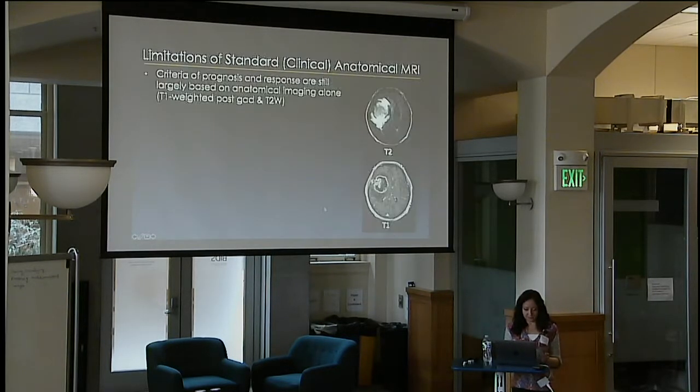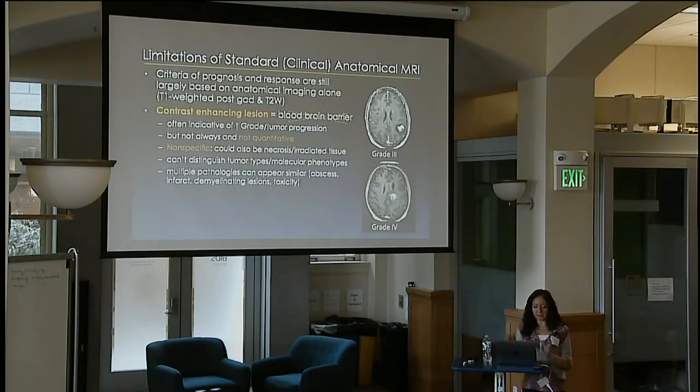So even though these standard anatomical imaging are used as the criteria for prognosis and response, there are several limitations associated with it. I'm going to try to go through this fairly quickly with the intent of then presenting how more advanced imaging can be and should be used.